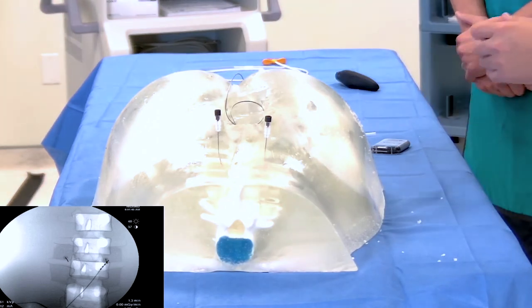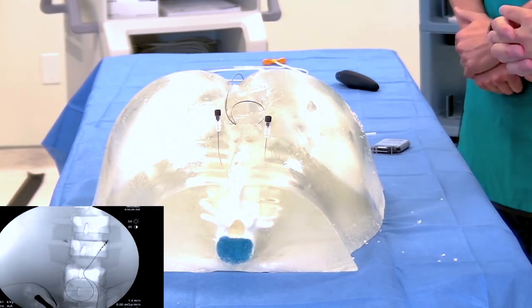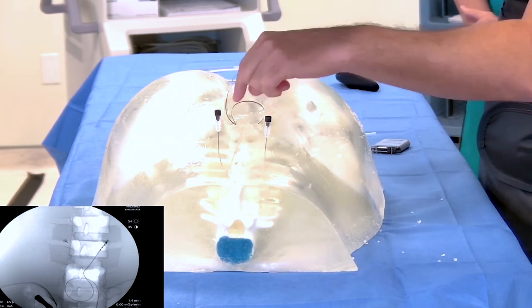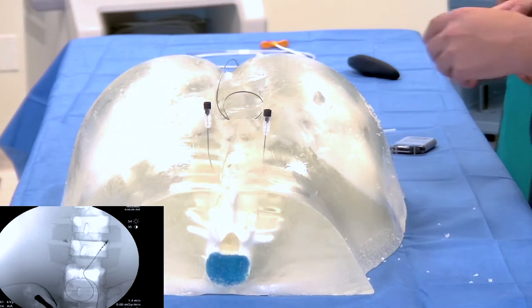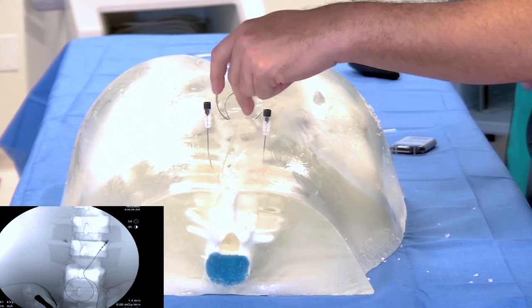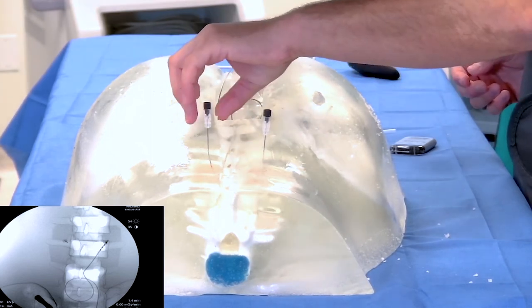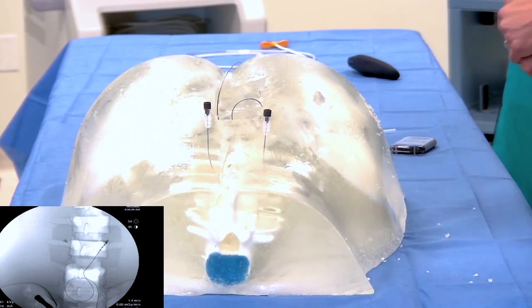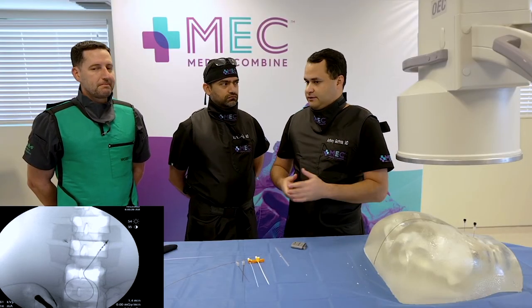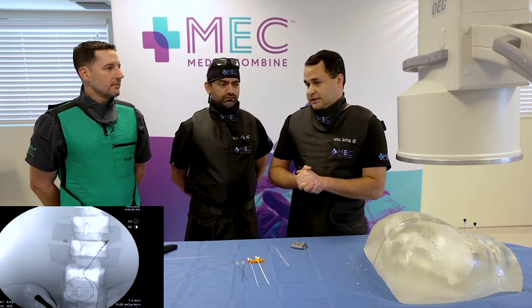You tuck the lead connector in on the ipsilateral side — make a midline incision, use your finger to make a little pocket underneath, place it in there, and then the battery goes in just like any other SCS battery. Post-op, close with deep sutures and then use Close-X, staples, or suture on the skin — whatever you prefer. No antibiotics needed post-op; I don't give anything for pain post-op. Tylenol and ice works wonders. If a patient needs anything, a day or two of pain meds.